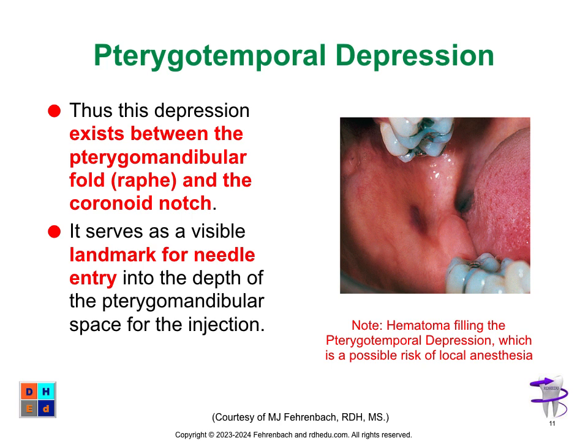We make sure always to avoid too much of this. Again, with some people with their health history, we can't avoid it. Maybe they don't know that they have a bleeding disorder. Maybe they're taking medications that promote bleeding. Sometimes they don't tell us everything. Remember to update your health history. Also, again, use that long 25 gauge. Make sure you're using that.